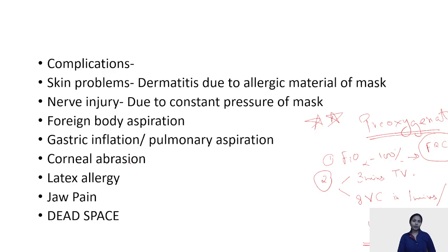There's one more technique of pre-oxygenation, which is the CPAP technique, in which the CPAP mask, continuous positive airway pressure mask, is applied for 5 to 10 minutes and positive airway pressure is given to the patient to pre-oxygenate. This is generally done in cases of obesity or patients who have basal atelectasis of the alveoli. So these are the 3 most commonly applied techniques for pre-oxygenation using your anatomical face mask.